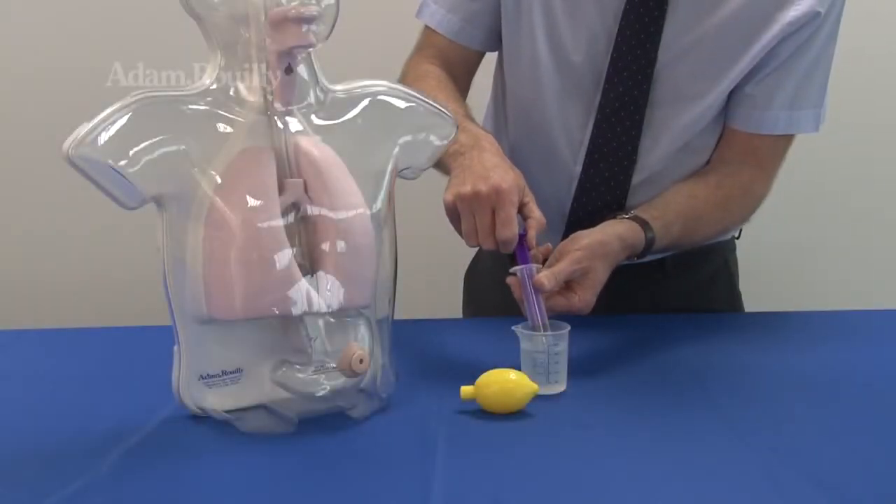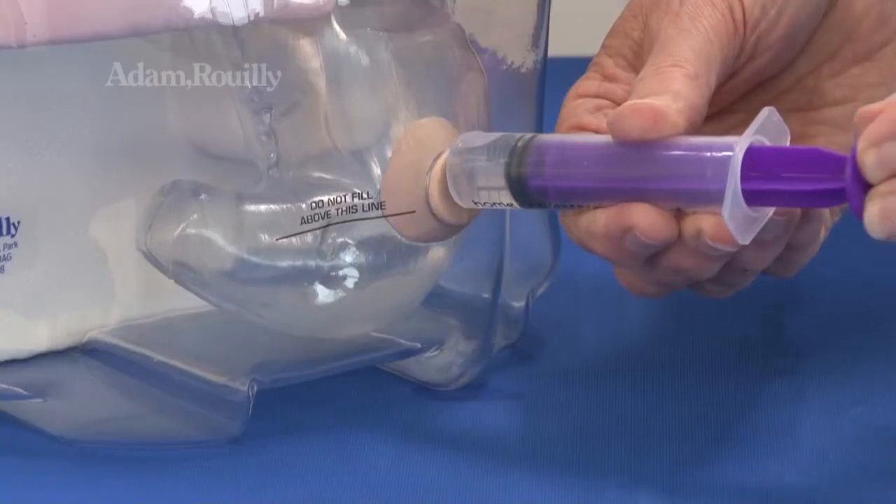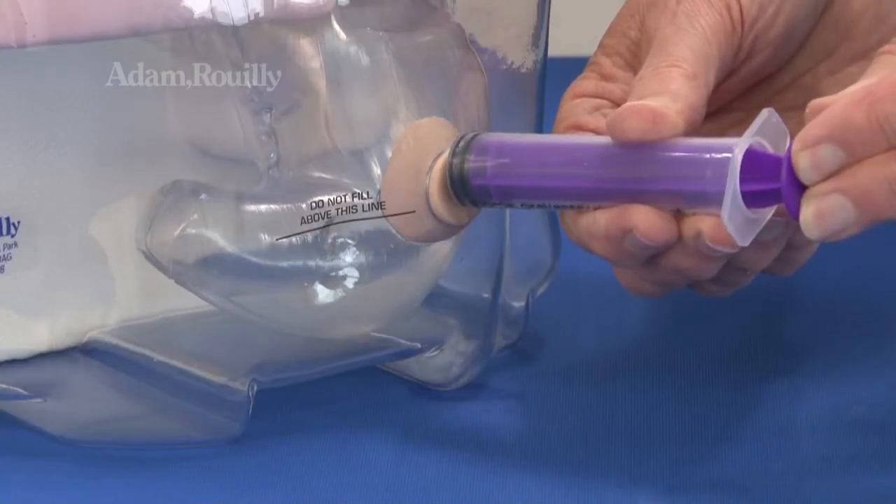Before use: mild acidic stomach aspirate may be inserted before training using the 20ml syringe and gastrostomy opening.